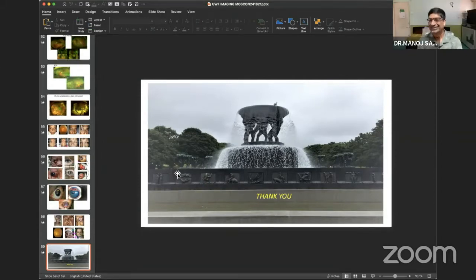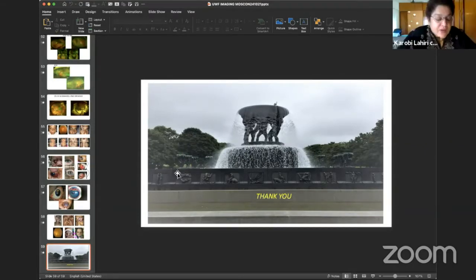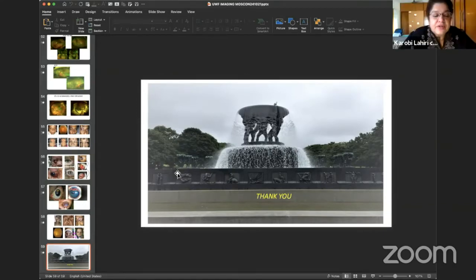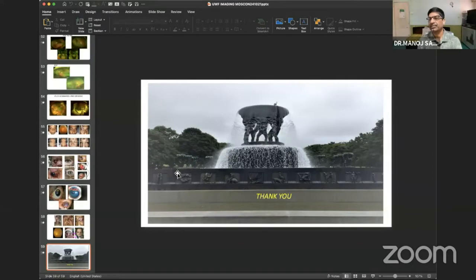One at a time, please, madam. I wanted to ask you, in children, as in the older machine, you had to use the flying baby position. Same thing here also? Same thing also. We have to take out the cover and open the camera fully and adjust the flying baby according to the picture. It is a little bit tricky. It takes some time because babies do not fixate properly. So sometimes you won't get a picture, but once in a while you get a good picture also.